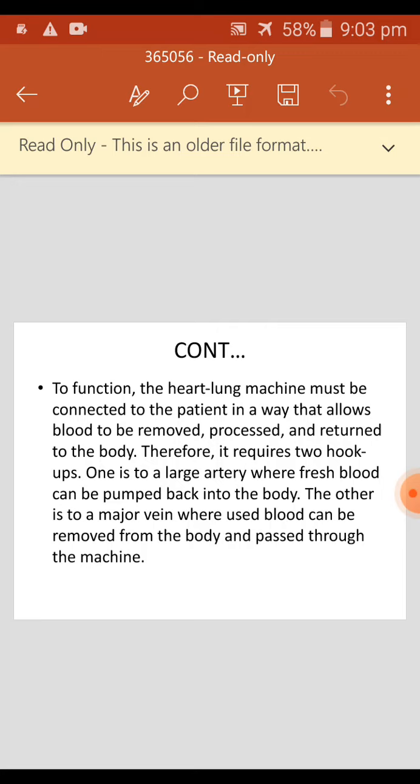Components of the heart-lung machine: mobile console, another one is adjustable mast system. The mobile console is for mounting multiple pumps, the power supply, emergency power supply, and last one is electronic parts. Second one of the heart-lung machine components is the adjustable mast system for mounting the holders for the oxygenator, filter, cardiotomy reservoirs, external pumps and additional devices.